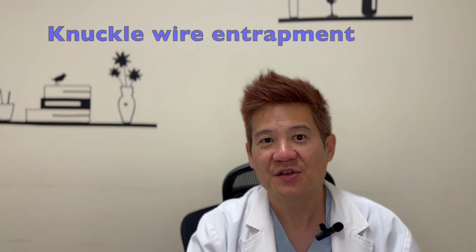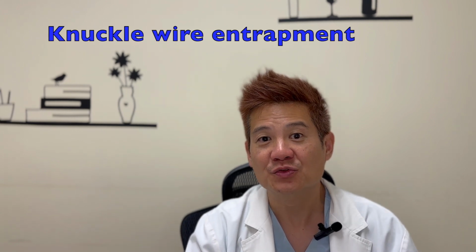One particular CTO equipment entrapment is the knuckle wire. So knuckle wire is used really to get into subintimal space to remove ambiguity in CTO. But often, if we rotate, especially if we rotate the knuckle wire, the knuckle can turn into a knot and get entrapped in the vessel. So it's important when we push a knuckle wire not to rotate it and just keep pushing it.